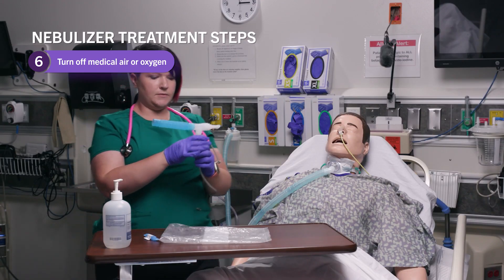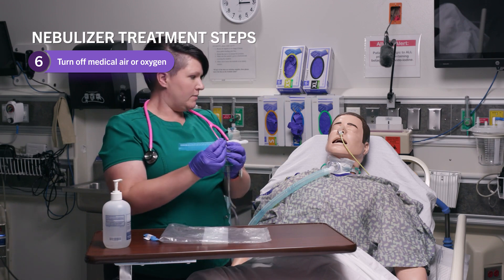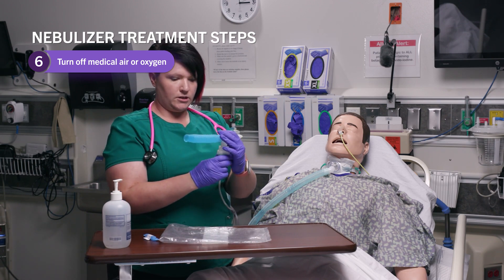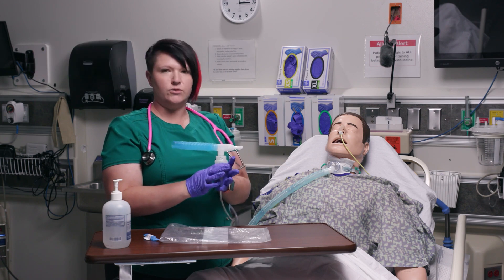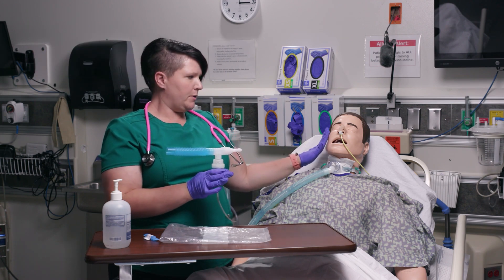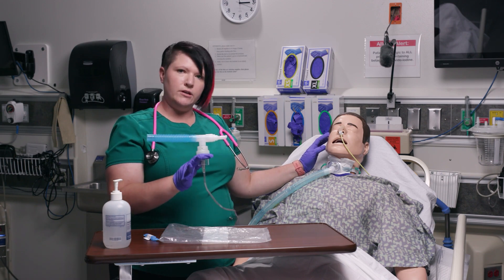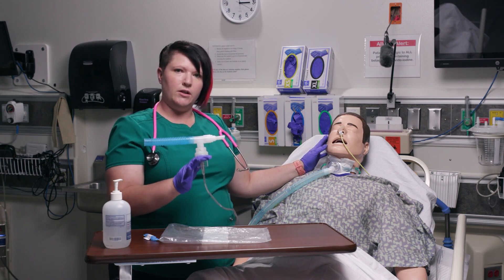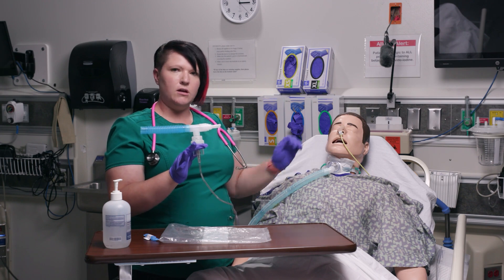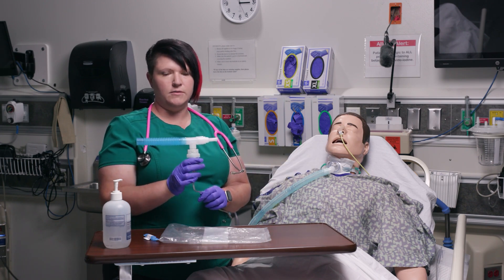We have given Mr. Jones the treatment. I want to talk about the choice between medical air and oxygen. If my patient were wearing a nasal cannula, I could leave them on that oxygen and still use medical air for the nebulizer, as long as I leave that nasal cannula connected to oxygen.